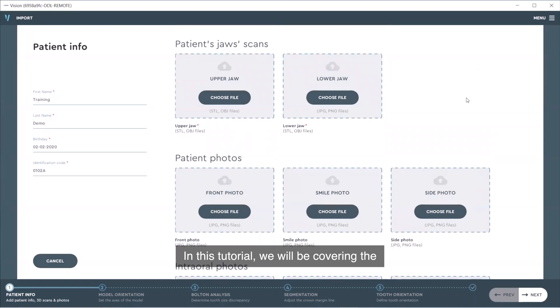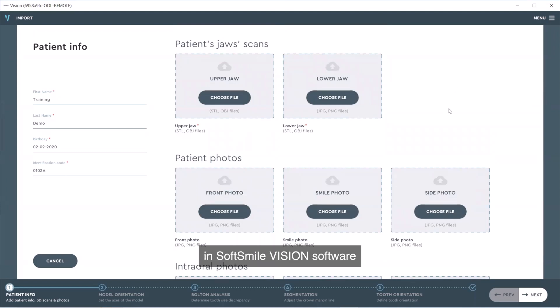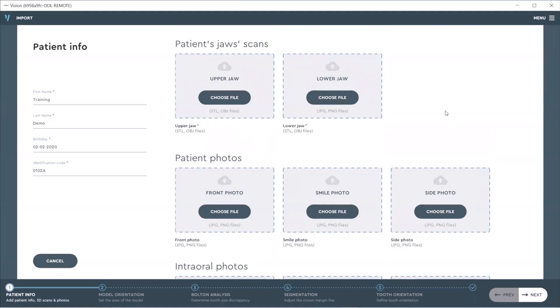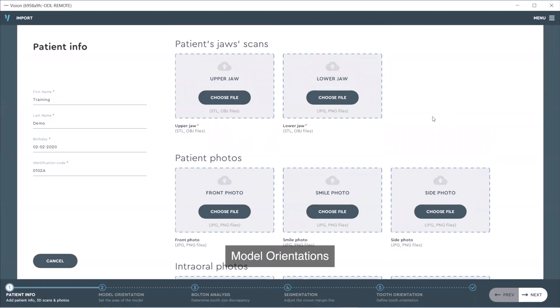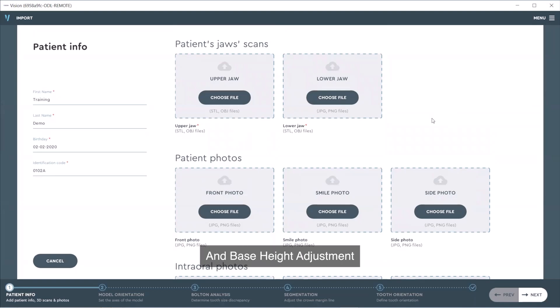In this tutorial, we will be covering the pre-processing stages or scenes in SoftSmileVision software. We will go over the uploading of a case, model orientation, sculpting, segmentation, root alignment, and base height adjustment.